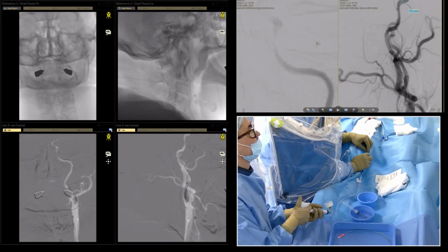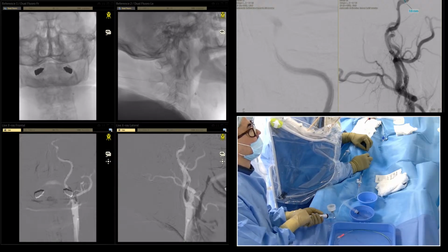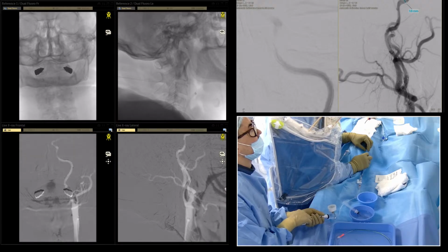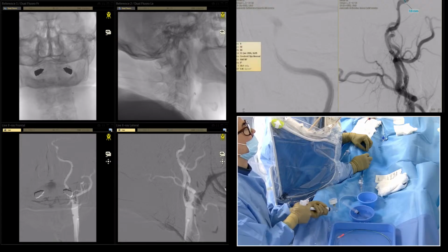We gave 18 atmospheres. That's quite a hard plug.